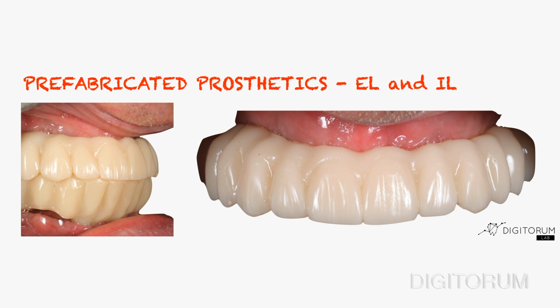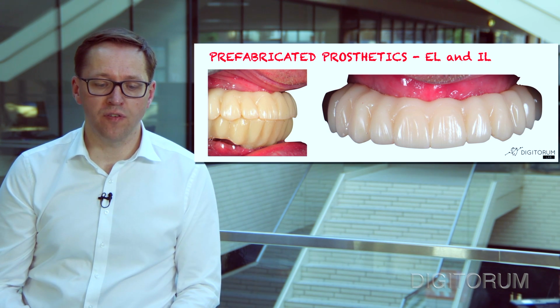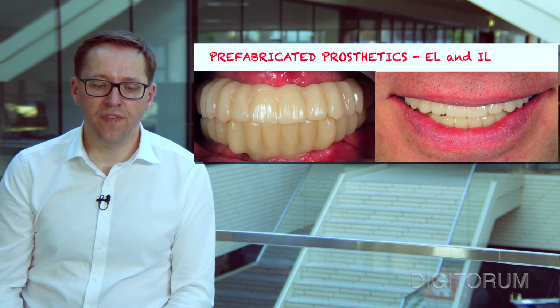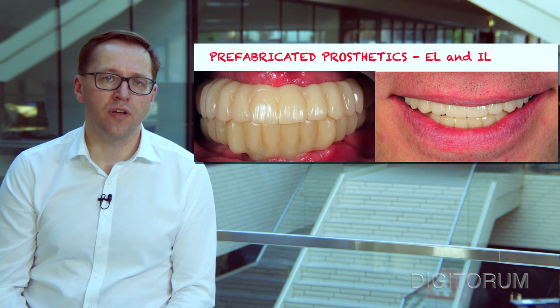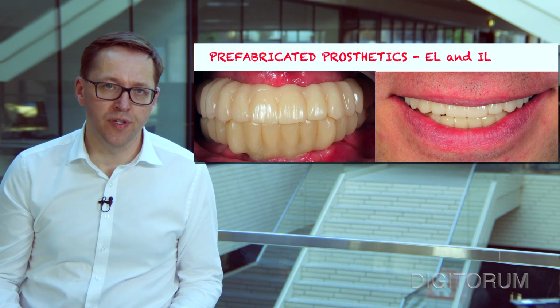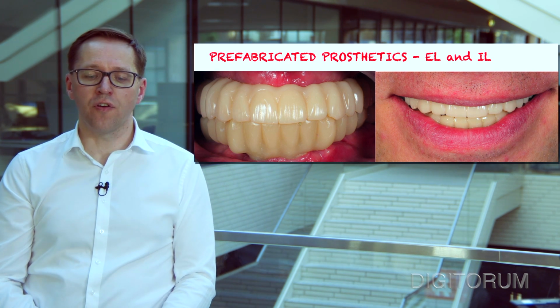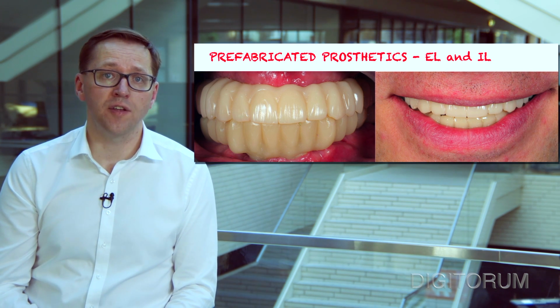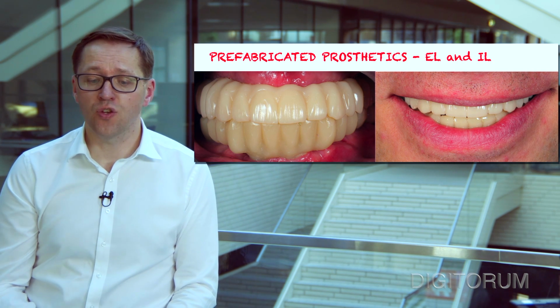So here's the case. Well, the healing progresses, and we are able to evaluate the phonetics, the occlusion, aesthetics, cleaning ability of the patient, and many other important factors. However, we see quite a nice result with the temporary restoration, and then it's a no-brainer to reproduce this in the final restorative materials. We have a good starting point for the prosthetic procedures. So this is the value.